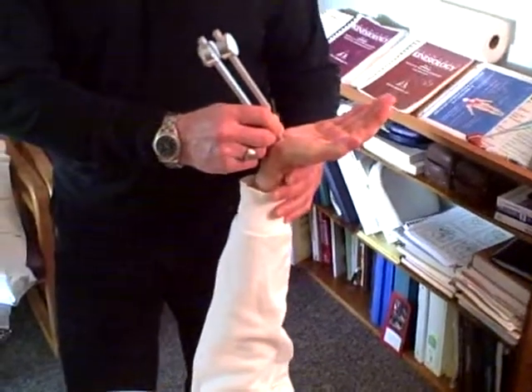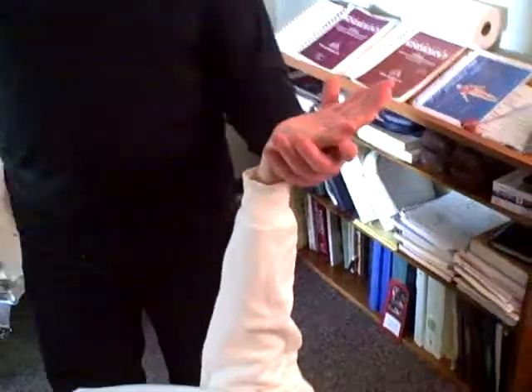We're going to put this on once more and now retest. Try and hold your hand back now. A little stronger, isn't it? I'm pushing just as hard. Now hold your arm — I'm going to push in, you hold it there. Now bring your arm all the way into your side, keep your elbows straight, I'm going to pull off.